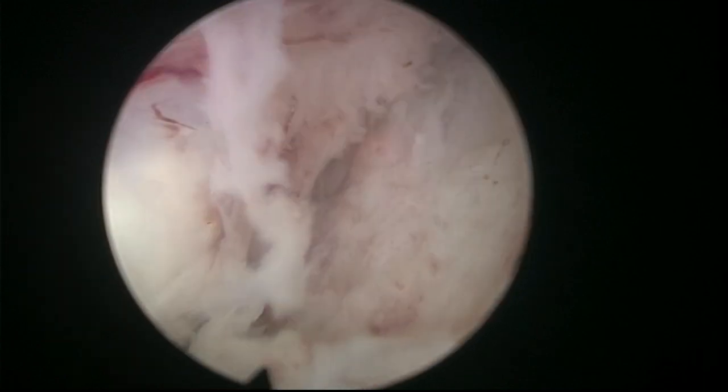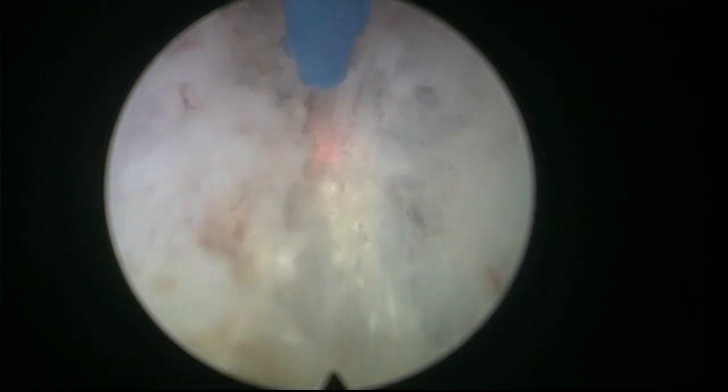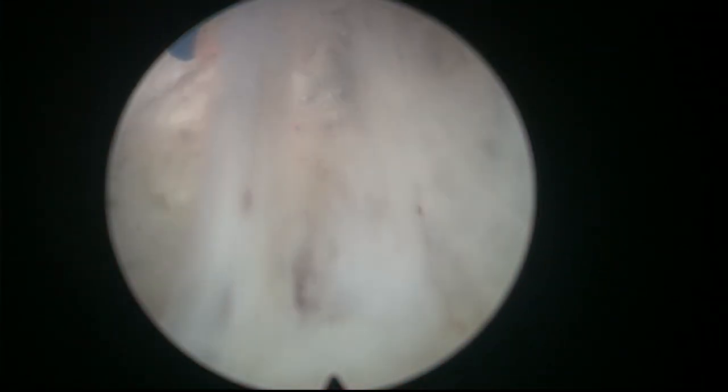Okay, so as I said, some people think this piece of tissue anteriorly, this piece of BPH tissue, has to be, let's say, respected anteriorly near the sphincter. In my opinion, that's not necessary, and I believe that it's more important to preserve the mucosa.